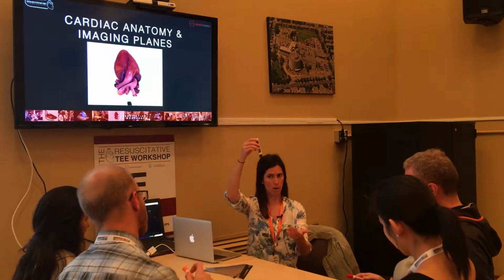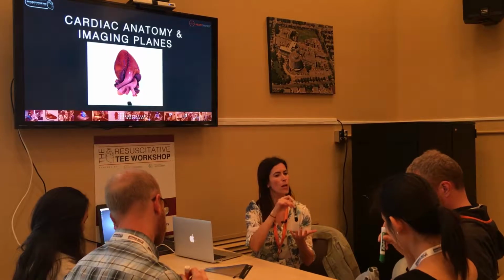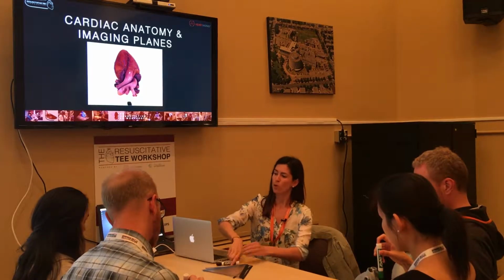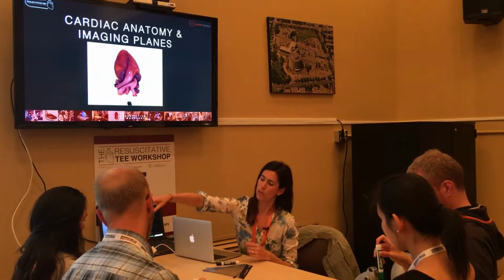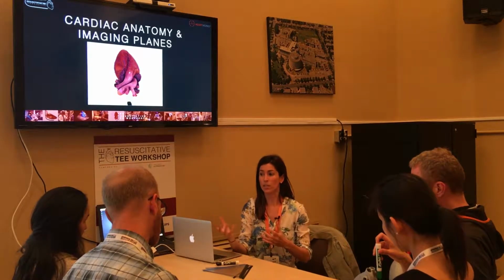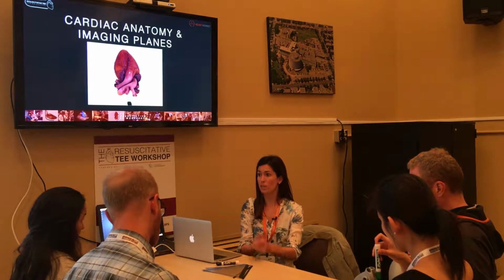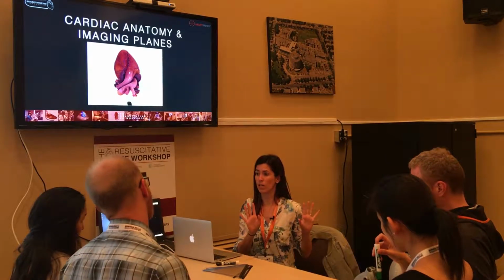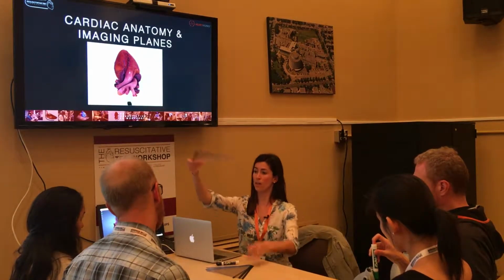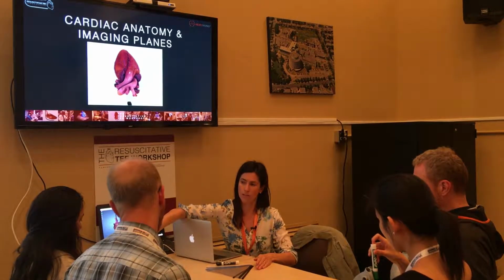Okay? So take that probe, holding your heart, and advance it down the esophagus. Tell me kind of where that's going to be in your heart. Exactly. So turn yours around for everyone to see. What you've done is you've put the probe right down the esophagus, and tell me about where it's located in relation to that descending thoracic aorta. So that descending thoracic aorta is located to the left and slightly posterior to your probe. If we had the vector that comes down out of the probe, would you be able to see that descending thoracic aorta?